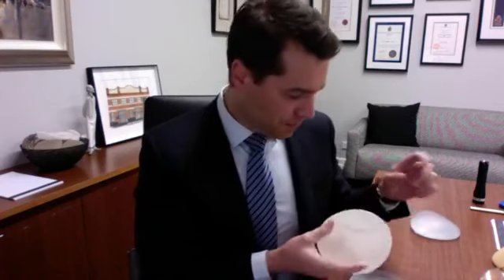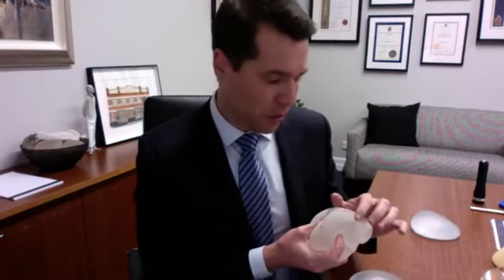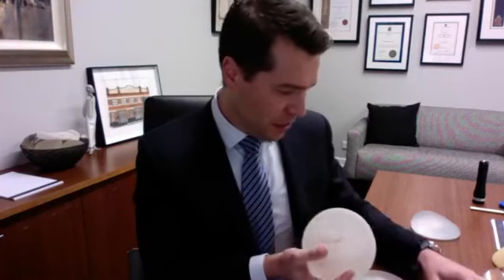What's the difference? The difference is the size of the actual pores present on the implant proper. And I'm actually able to feel these things, but the Natrelle implant feels quite sticky, as in you would put it in someone and it almost feels like Velcro. And that was the design. That's what they were made for. Your body was meant to incorporate into the surface so that it locked in, and you got this really good implant soft tissue interface so that you can create shape.